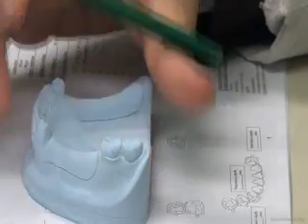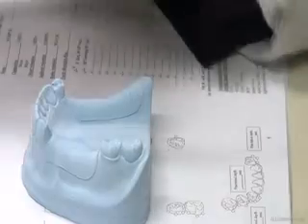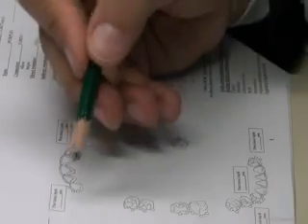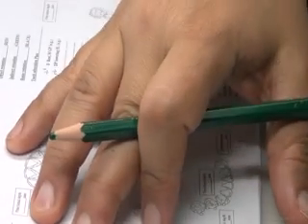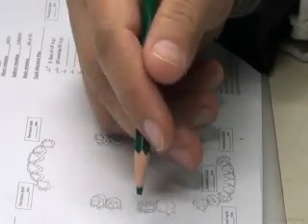Now, in the cases we have designed, we have not followed even the simplest design. I'm going to talk first about the simplest design, and then move on to how we change it. Okay? So, we have a bounded saddle. Any bounded saddle. Let's say we have a bounded saddle here. In the lower, we're talking about the lower left, page 3, lower left area.